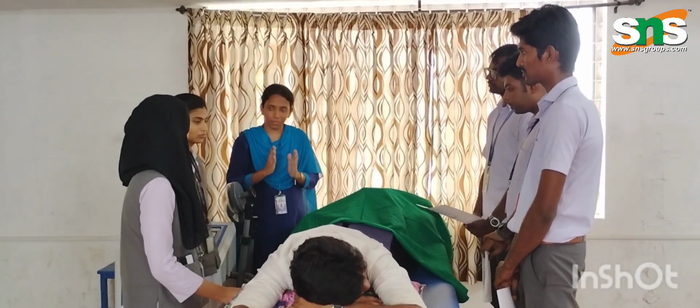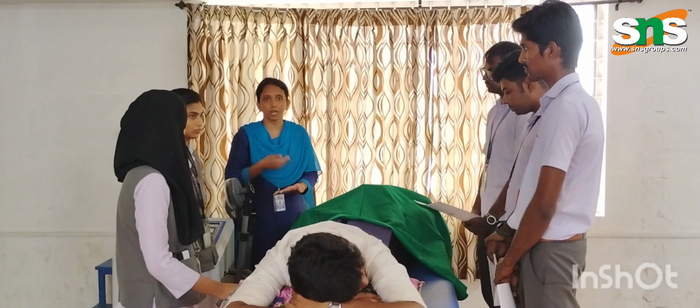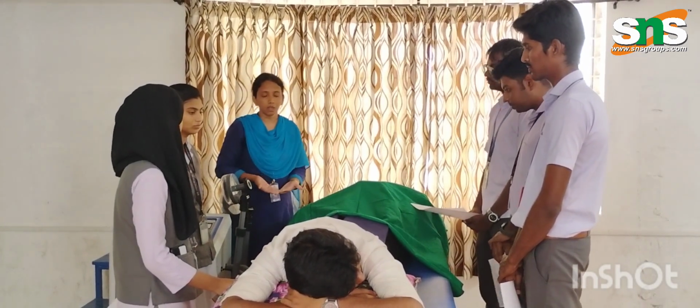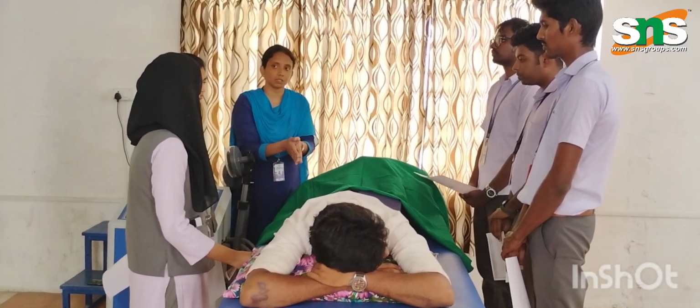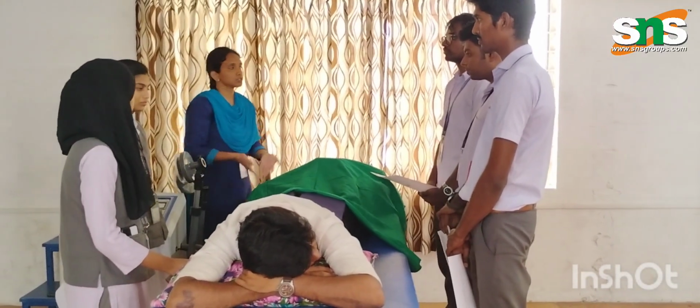So the patient's mild warmth sensation should be addressed during the treatment. We have to ask the patient continuously throughout the treatment. And we should not interfere with the electromagnetic transmission of the waves during the treatment session. We have to be at a safe distance from the patient. So what is next?